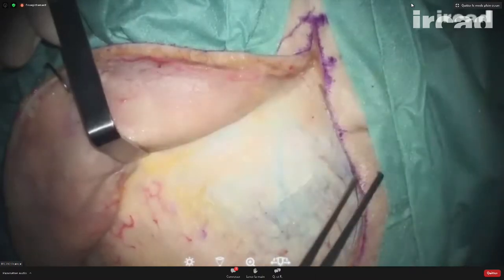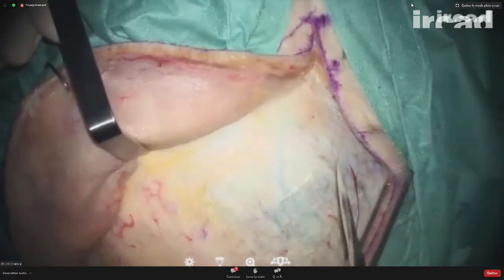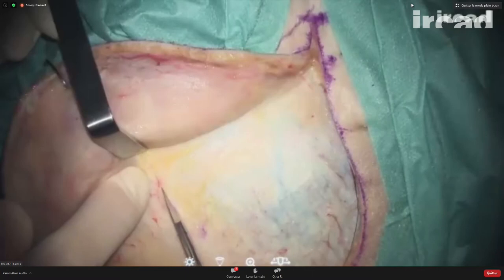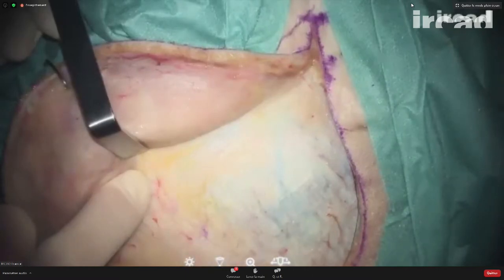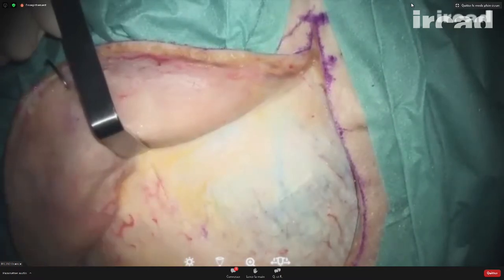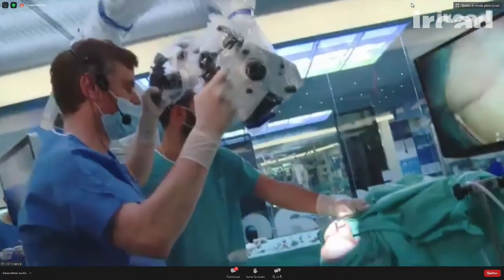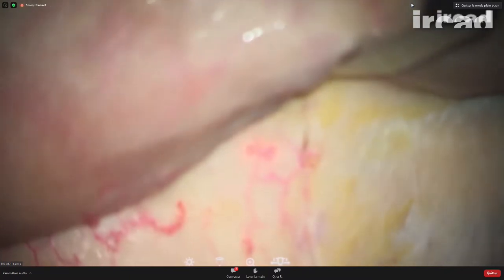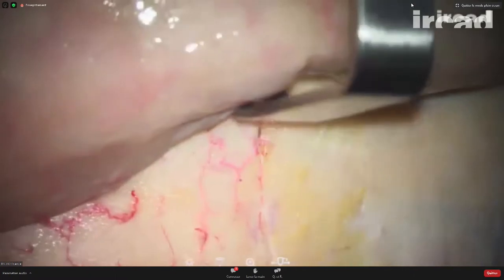Here posteriorly, I have the limit of the temporalis muscle insertion. So I make an incision here along the superior temporal line. And here, just in this area, I can identify the two layers of the temporalis fascia.